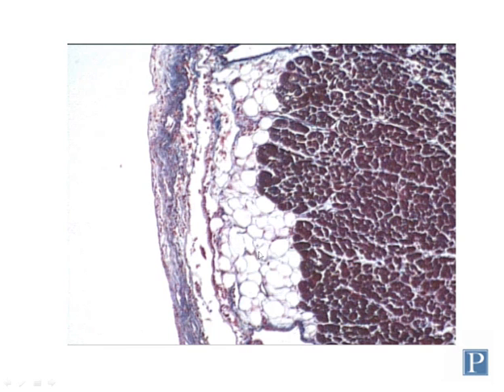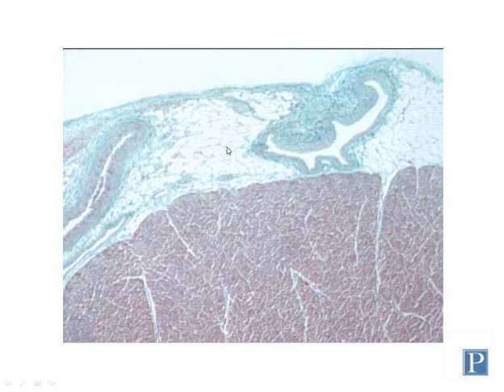In addition to adipose tissue and connective tissue, you can often see blood vessels through this region of the cardiac wall. You can also see some nerves, things like that. Here's another view of the epicardium where it's particularly thick. Lots of fat here. Here's a couple good-sized veins traveling in the epicardium. So make sure you can distinguish between epicardium and endocardium and observe the different layers of each of those tissues.